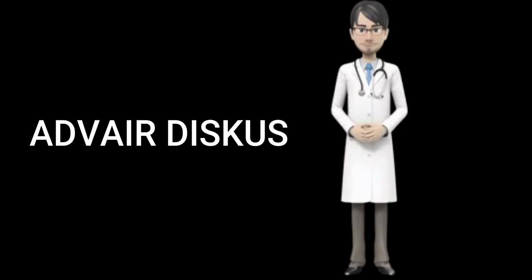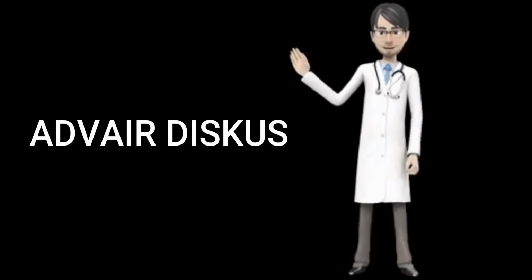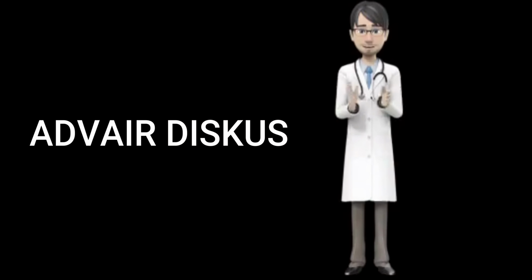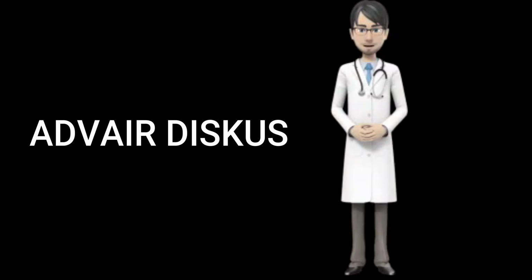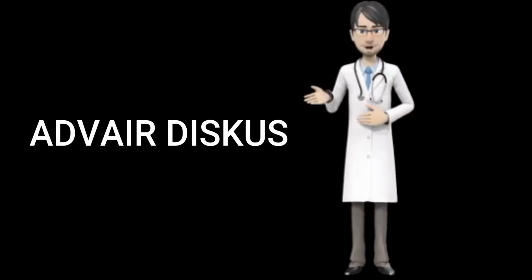Before you use Advair Diskus, Advair HFA, or AirDuo Respiclick for the first time, read the written package instructions that come with it. Look at the diagrams and package instructions carefully and be sure that you recognize all the parts of the inhaler. Ask your doctor, pharmacist, or respiratory therapist to show you how to use the inhaler. Practice using your inhaler while they watch, so you are sure you are doing it the right way.